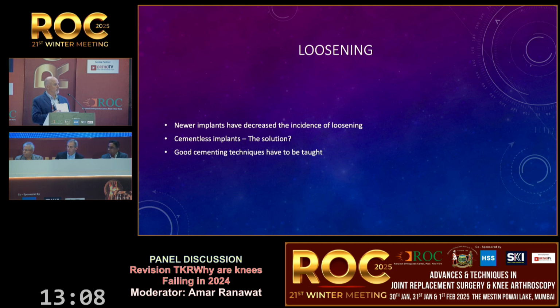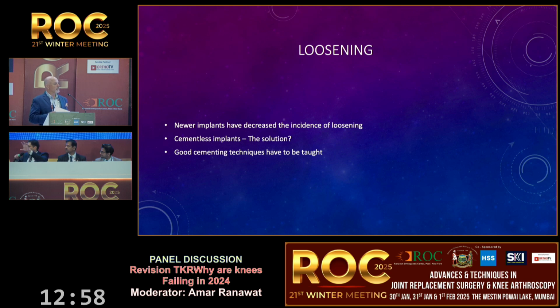Do you think cementless can be done with equal efficiency with manual jigs, because of the issues of blade skiving and everything? With robotics, you have perfect cuts, so you get a very good fit. But with manual jigs, sometimes we'll have a femur where we feel at the trial that it's so good we can do it cementless. But the next femur will just go in and come off.